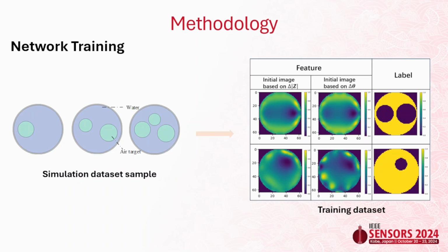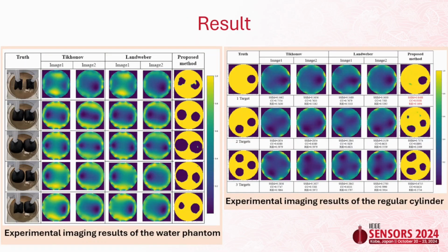And that's the training data sets we got here. So these are some final results for different sides of the bore, and you can see some improved results, which is in yellow. And we also have some other results based on the plastic bars, which is kind of showing even better results, because I think the training data is based on that. So they get better results over there.